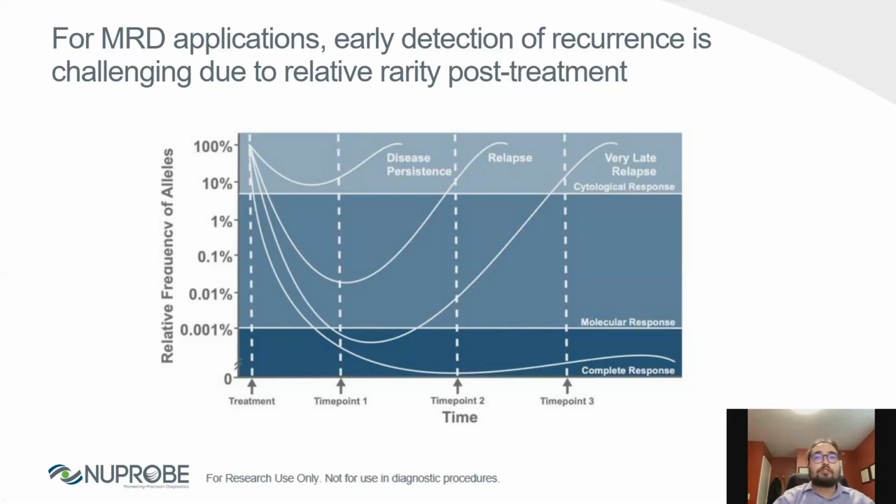While there are certain error-correcting NGS methods that have been employed that are able to detect mutations at very low levels, these may be costly to implement, and they also may potentially show poor performance at single loci.